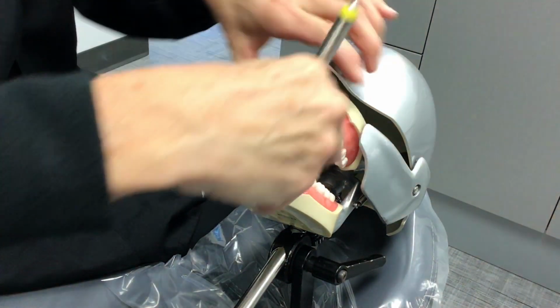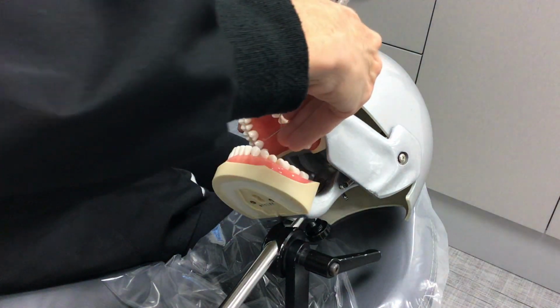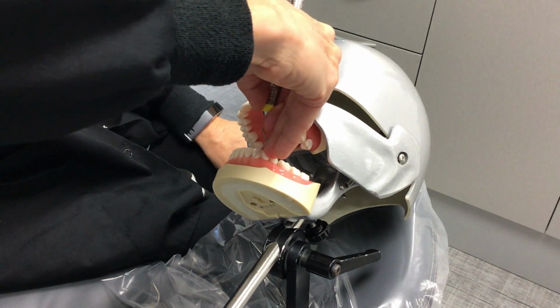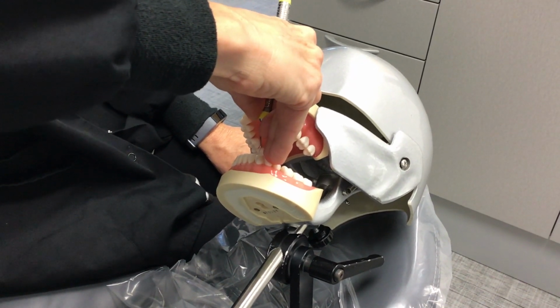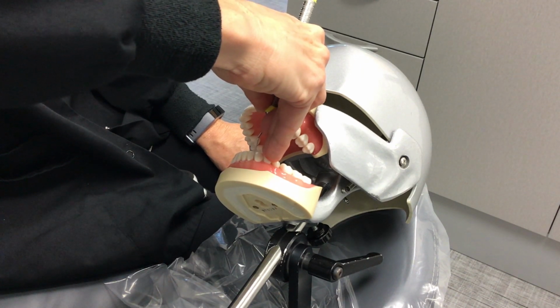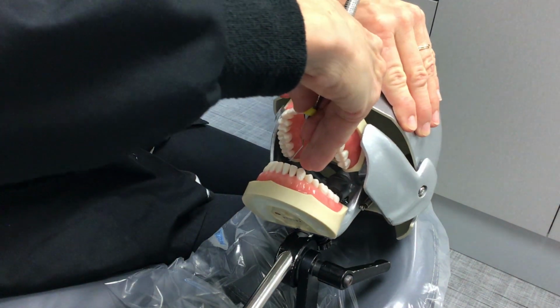I'm working on the canine here first, so my patient will be turned way toward me. I will place my fulcrum here and stand up on my fulcrum. I will insert underneath the tissue, and I will walk and roll my instrument to keep my tip adapted to the tooth. Again, as I'm working across, I will reach up and turn my patient.